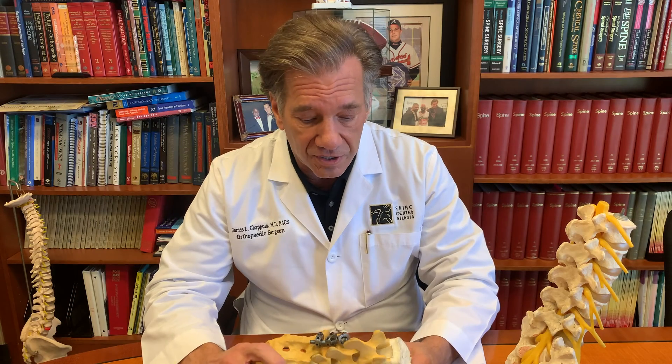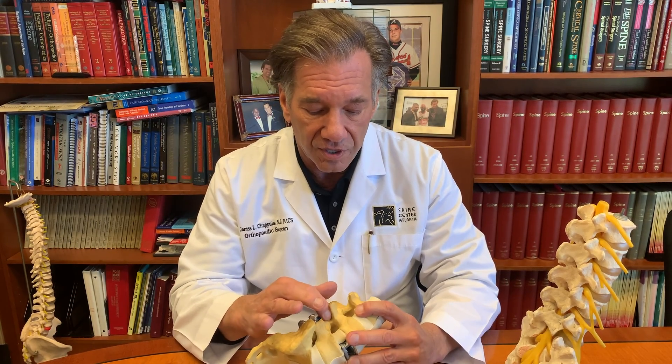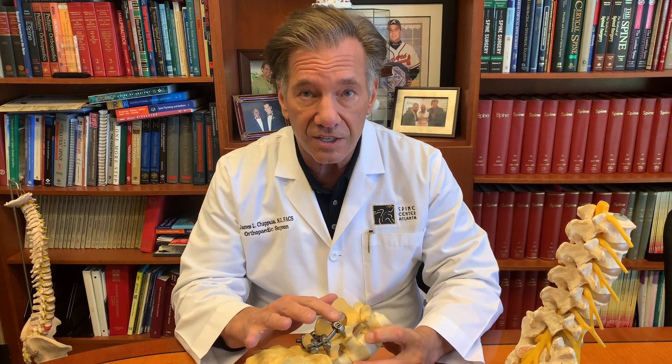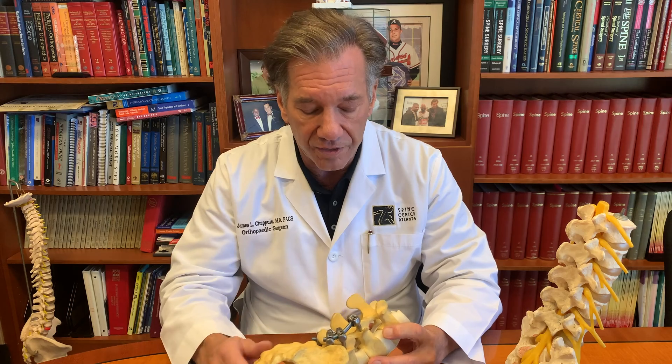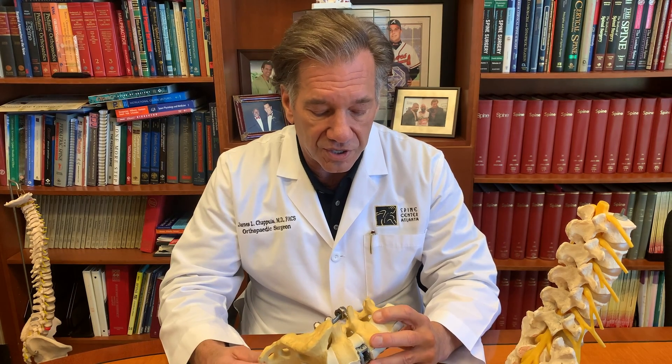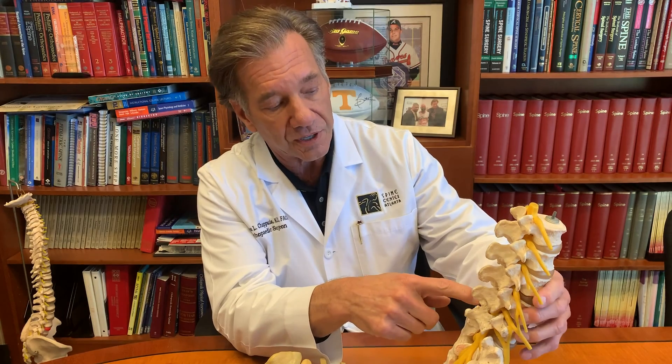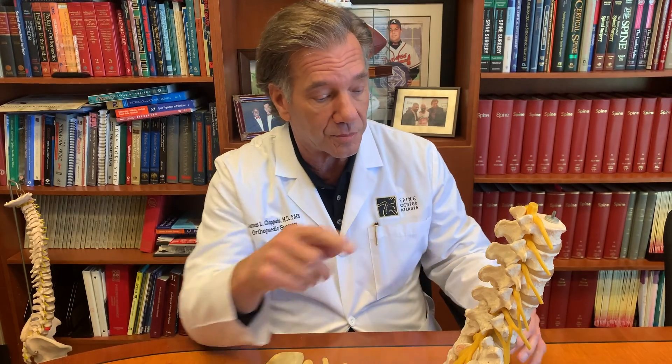So basically, this is a pedicle screw. There are three on each side, and they're connected to a side connector and a rod. These screws are placed down the pedicle of the spine, which is the pillar of the spine, and it goes into the vertebral body.